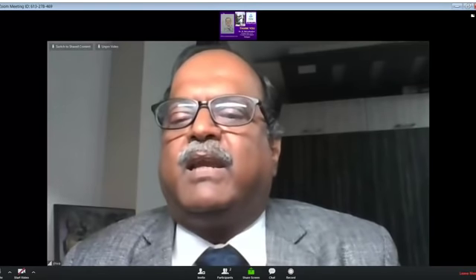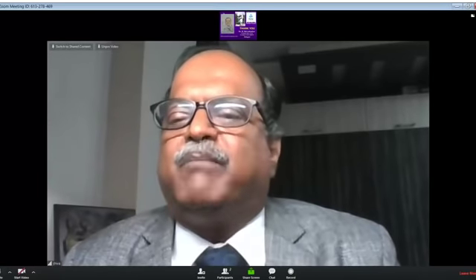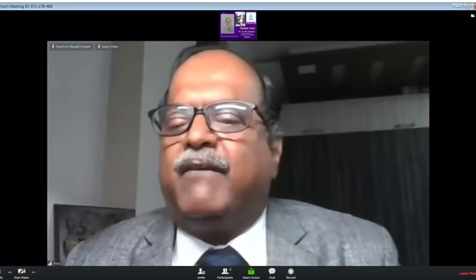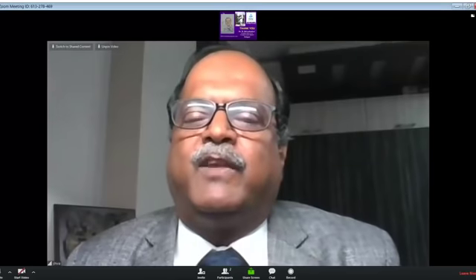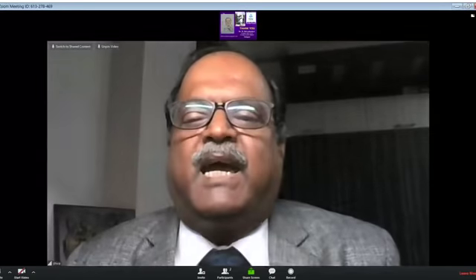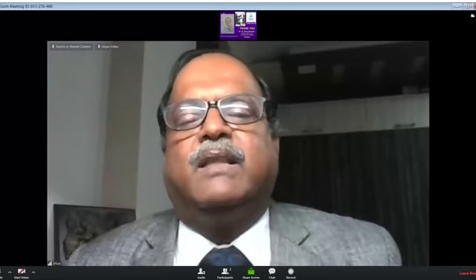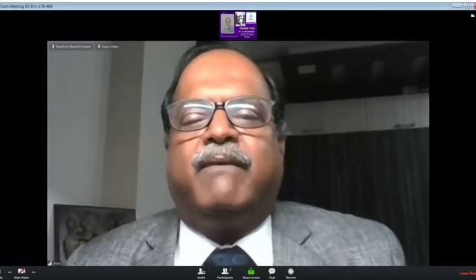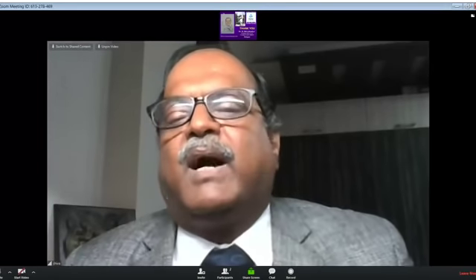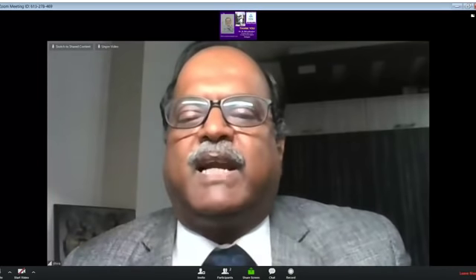As I said earlier, Dr. Naveen Thakkar from Ahmedabad came out with it about 6 years back, but that plate is still not available in the market except for a few doctors, including him. Then my friend Dr. Shashikant Ganjale came out with this plate about 4 years back, I also liked the idea and I had kept it in my armamentarium. In each and every case I do nailing, this is always ready on the table. But I never had the opportunity to use it, because I almost always get away by tightening the screw against the nail itself. By getting a good valgus reduction, I always get away with this.